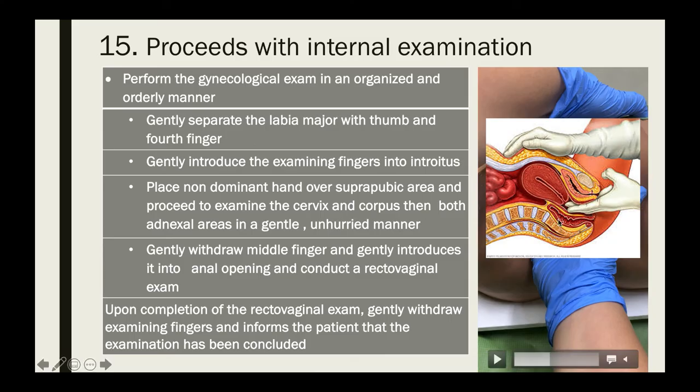Next, palpate the left and right adnexa. Pull your hand back slightly and move your fingers toward the right fornix to palpate the right adnexa. Then withdraw slightly and move your fingers into the left fornix to palpate the left adnexa.